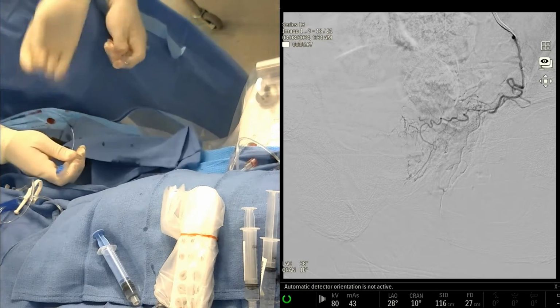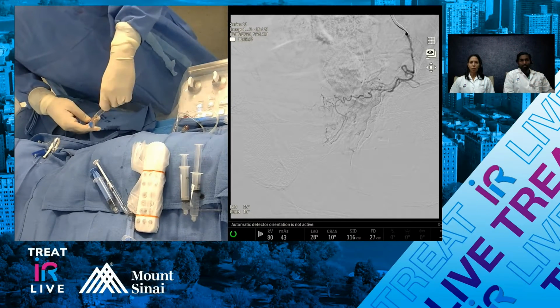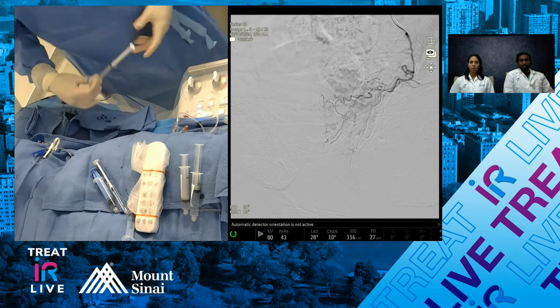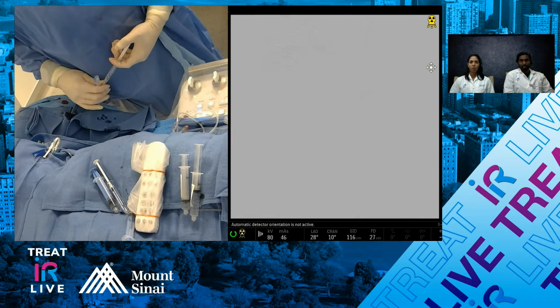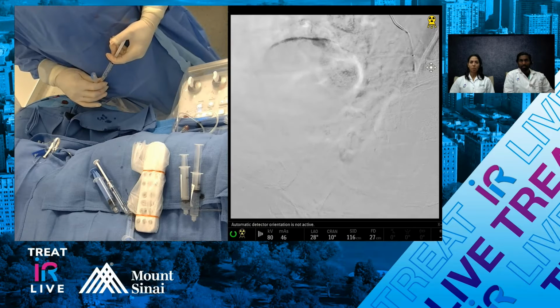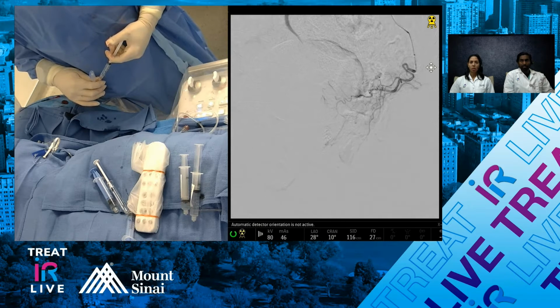Yes. Maybe we can backtrack a little bit and just talk about the in-office discussion. So here's our next angio. You mentioned a lot of alternative treatments that patients may be asking about. How do you counsel your patients in the office?